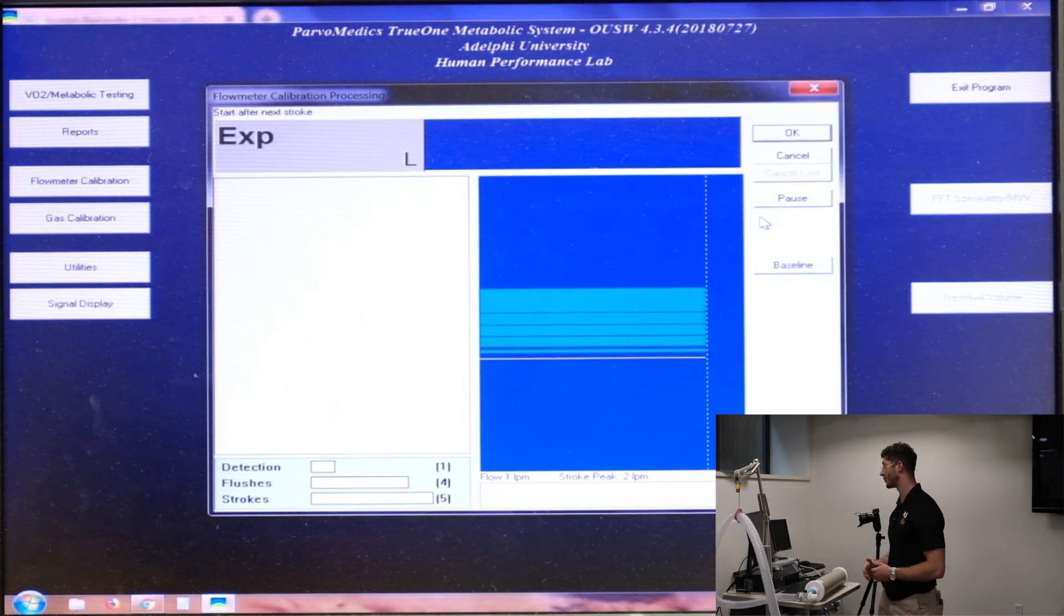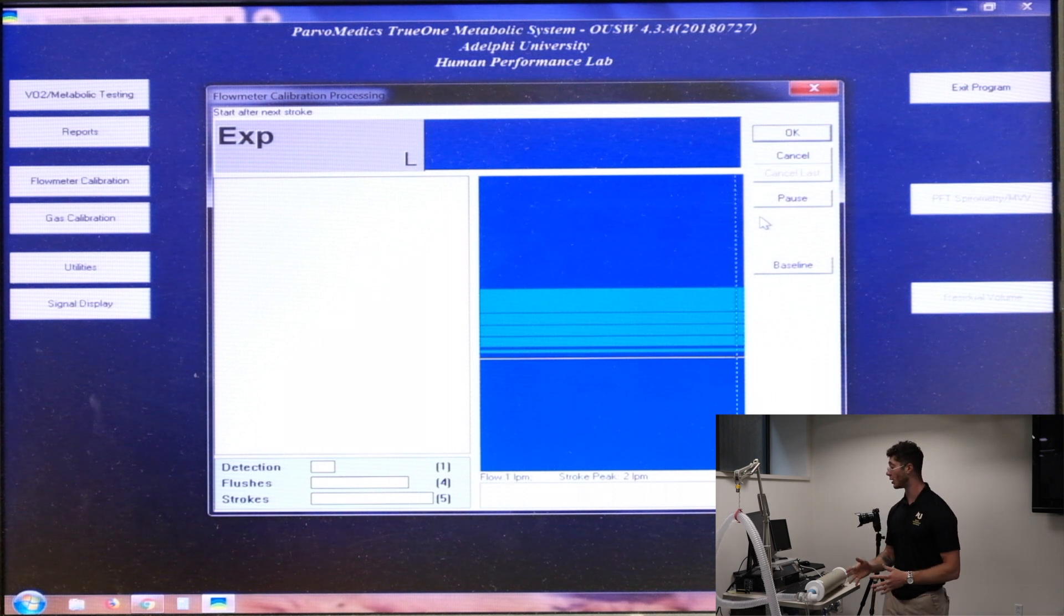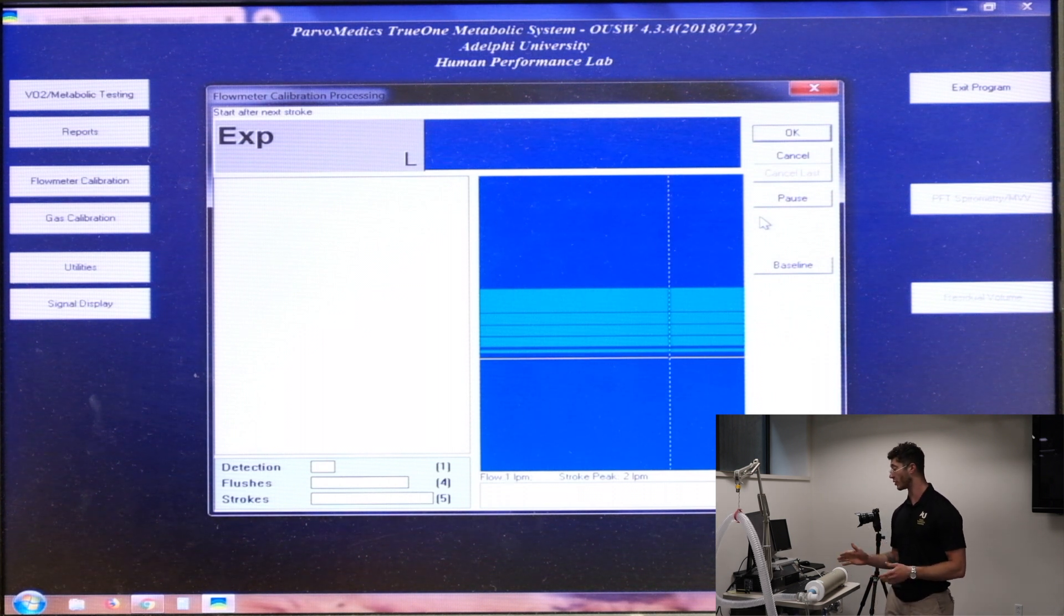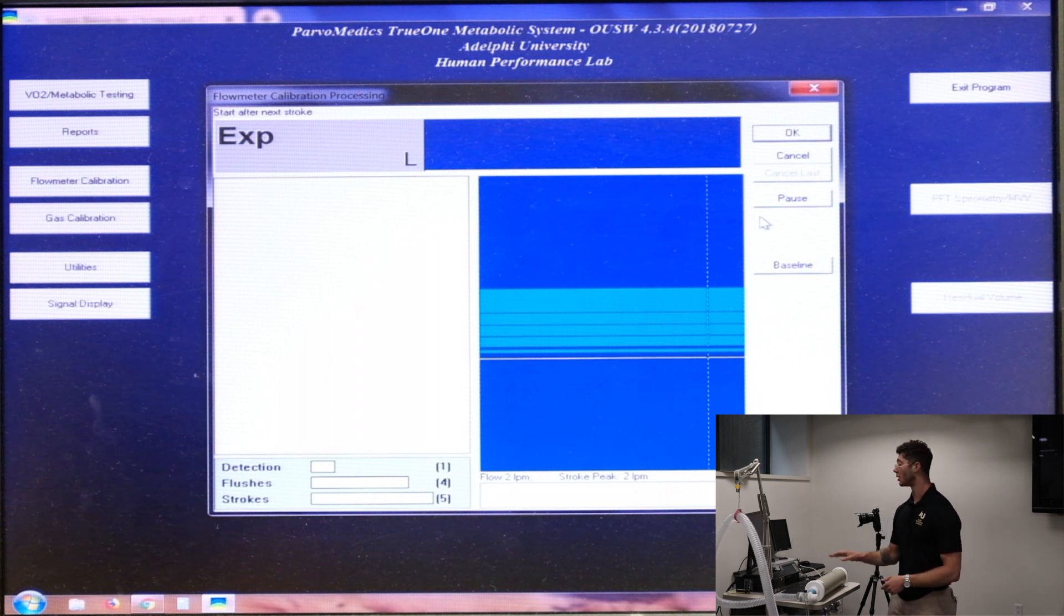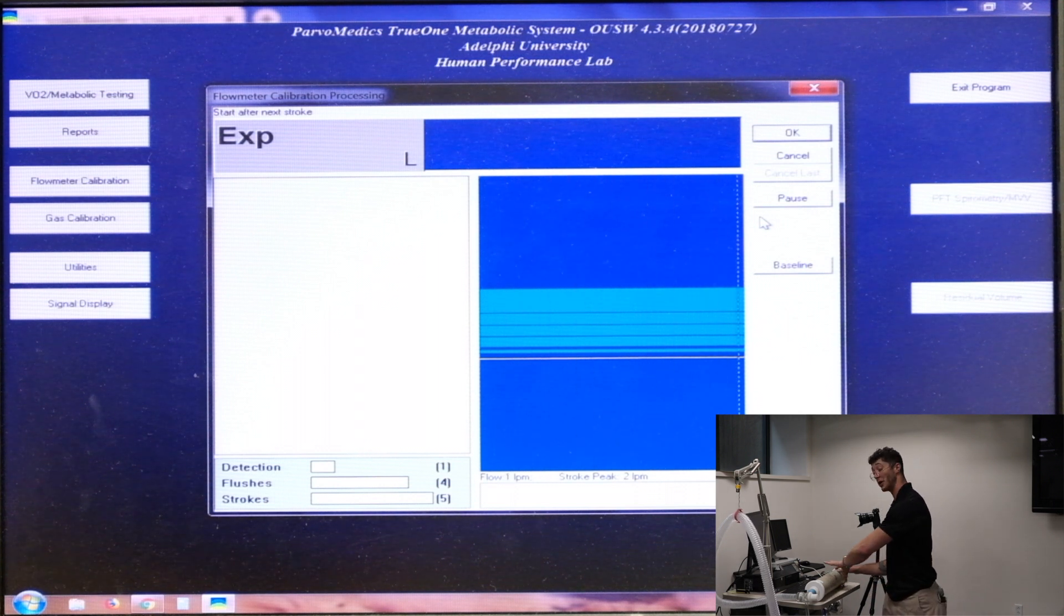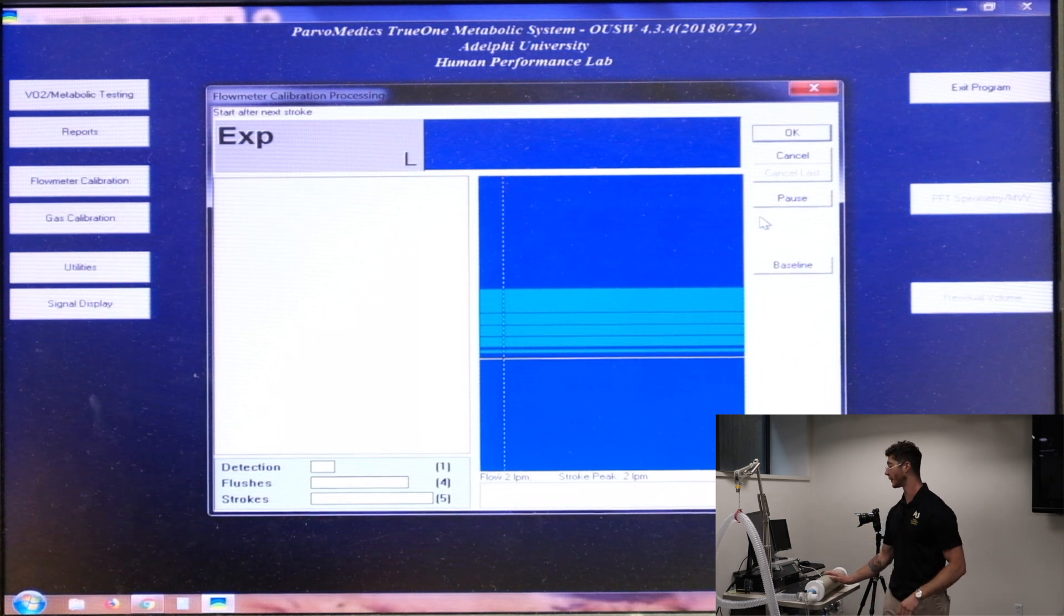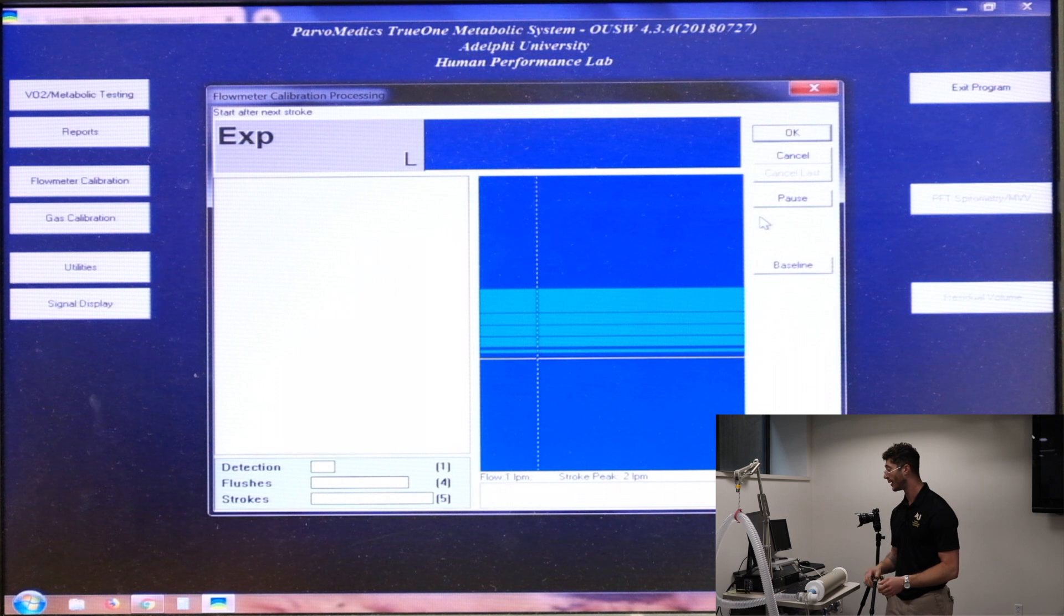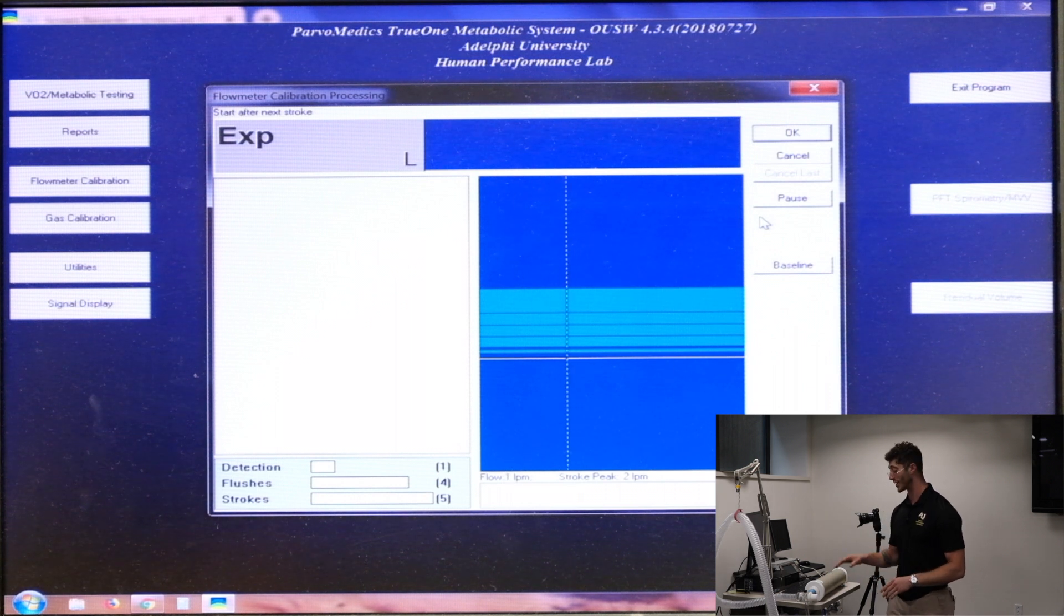So on the bottom left of the calibration screen, you'll see that it says detection, flushes, and strokes with numbers next to them signifying how many of each. The detection is just to detect that the air from the syringe is traveling through the system. The flushes are to purge any stagnant air. And the strokes are the actual calibration strokes.